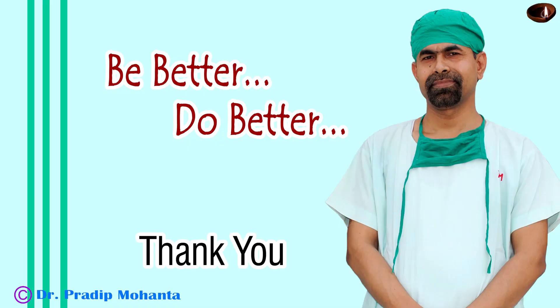Thank you very much for your attention. Hope this video will help you in developing your surgical skills. This is a totally unedited recording and we have completed the surgery in just seven minutes. But be safe always — before you become swift, always look at the safety of the movements that you are going to do.